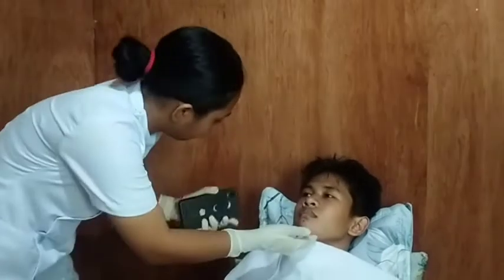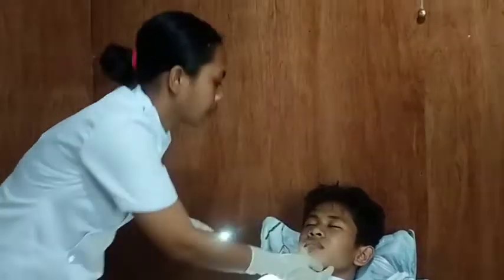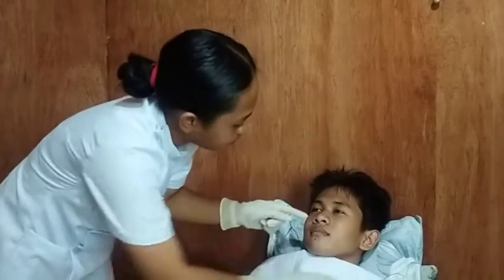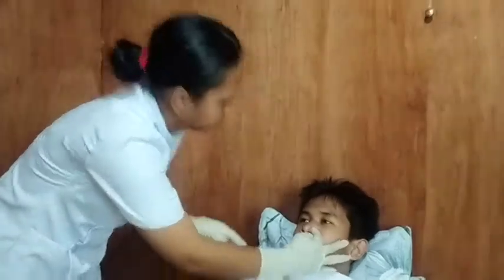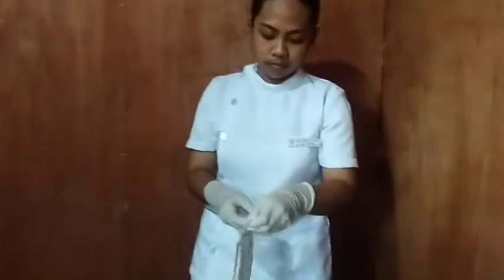Ask the client to hyperextend the head and, using a flashlight, observe the intactness of the tissue of the nostrils, including any irritations or abrasions. Examine the nares for any obstruction or deformities by asking the client to breathe through one nostril while occluding the other. Prepare the tube.